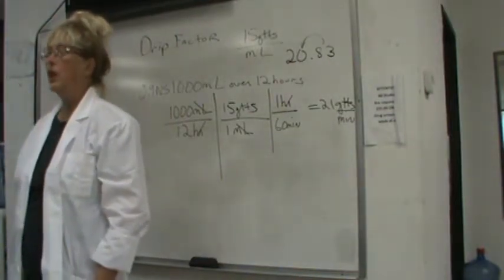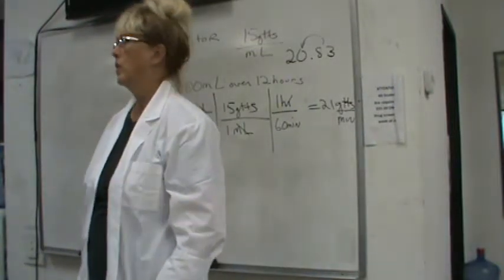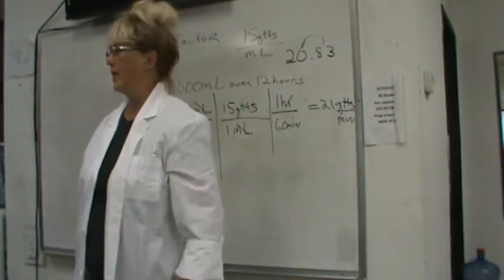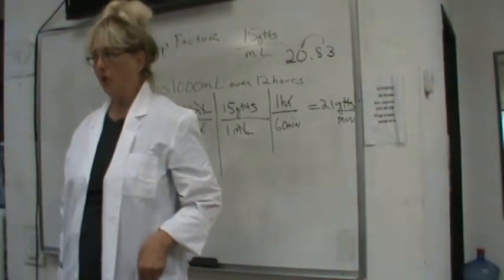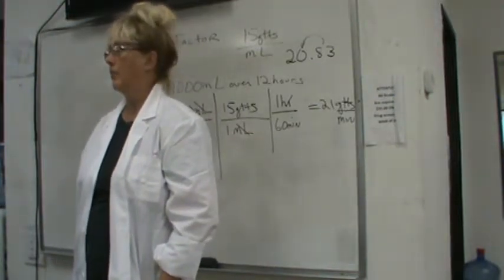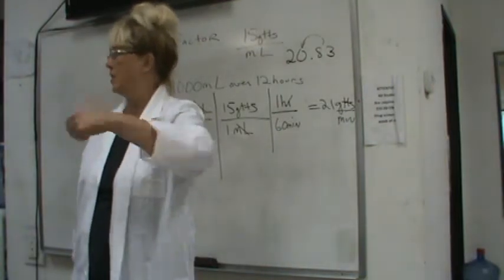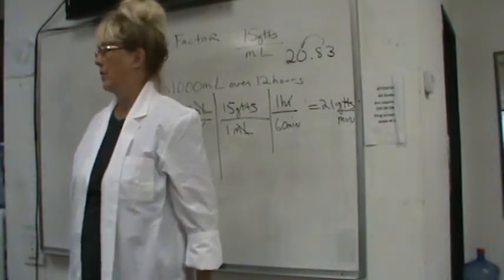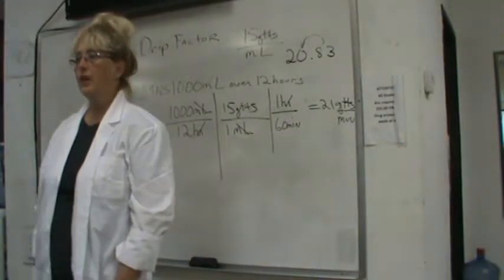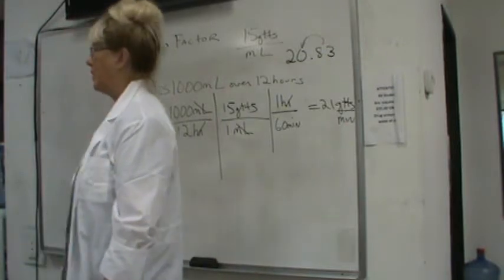Takes a minute, doesn't it? Do you know in nursing school we had to do this with a nurse looking over our shoulder? I mean, literally, they were standing right here and counting with us. Talk about pressure. And she'd mark us off if we were 1 or 2 drops off. And this is gravity feed. Sometimes if people move their arm or something like that, it's going to come down faster. So yeah. That's why you need air in your drip, you need room in your drip chamber so you can count it.